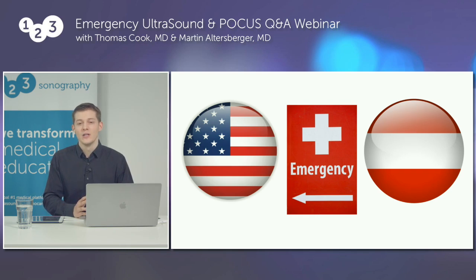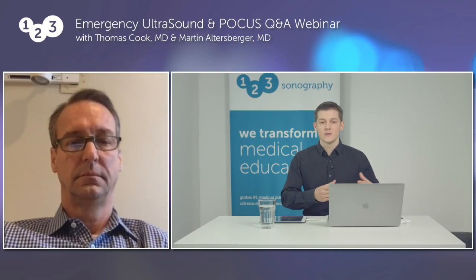When and how you decide to drain it. Before I hand finally over to Tom, I want to give a little bit of insight how I would do it. If there's a trauma present and you suspect that this trauma was in the area of the thorax and you think it could be blood, drain it. If the patient is unstable, you have to help the patient. No matter what you do in this situation with a thoracentesis, you cannot do anything wrong. So now I want to conclude my part and give the word to Tom.